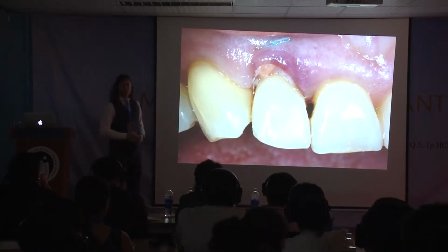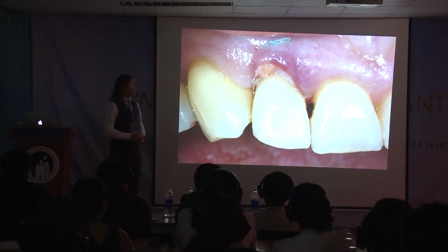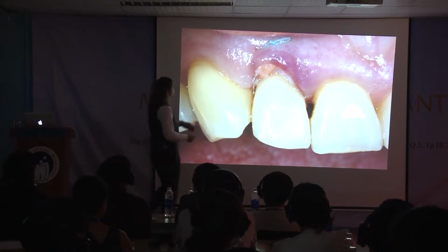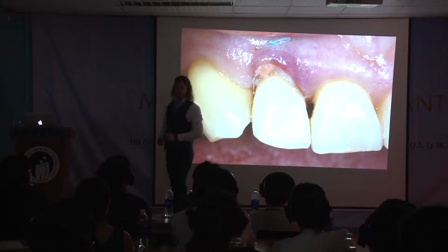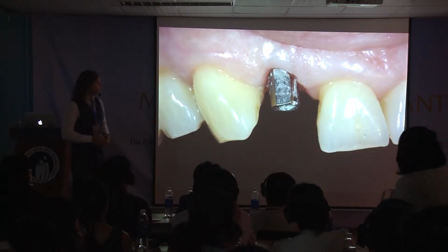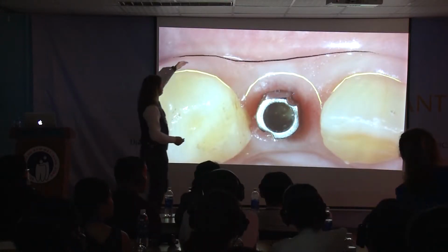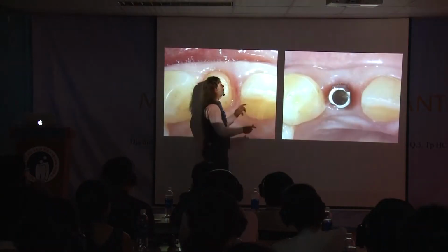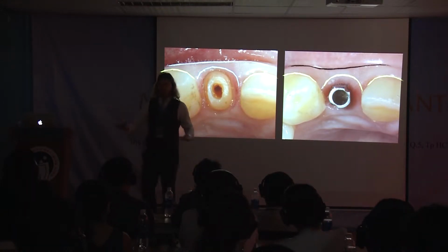So I immediately place the provisional with the final abutment. The provisional has an emergence profile that has to guide the maturation of this tissue. And this is after 1 year. We had a little bit of shrink, of loss. If we make a comparison, you see that there is a reduction. It always happens. This is normal.